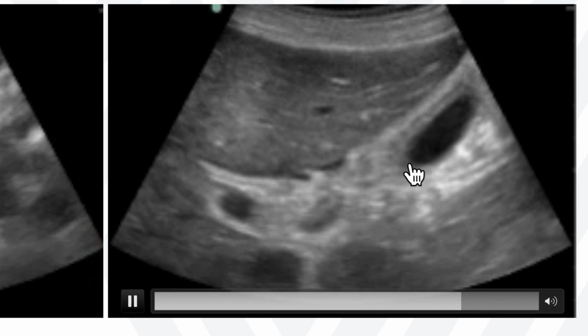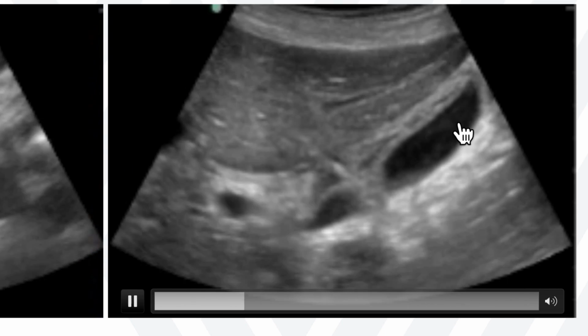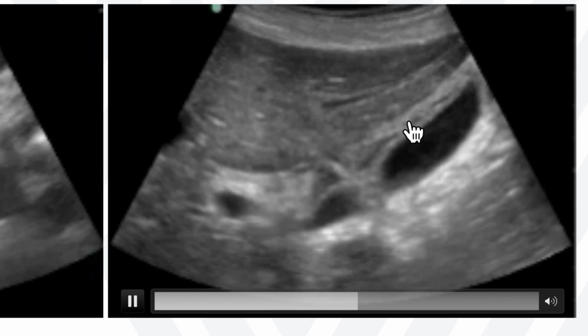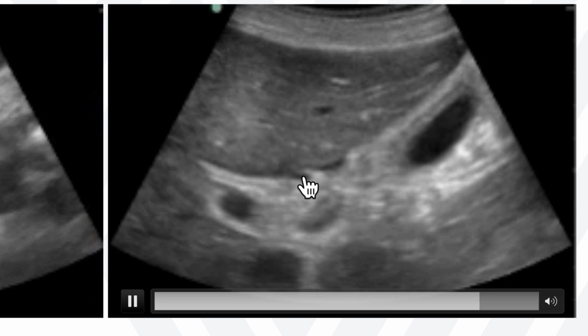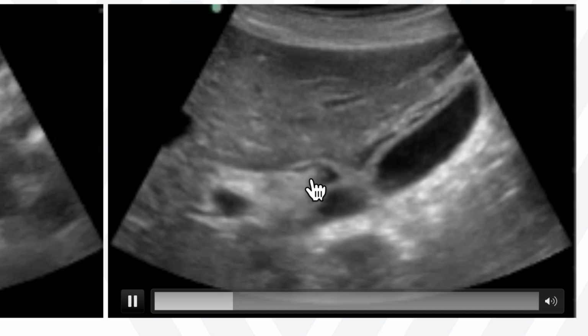In this longitudinal view, just point out liver, portal vein. Here's this gallbladder. I don't see stones or anything in it, but we definitely see a thickened, kind of layered, irregular looking wall. We even see a little bit of pericholecystic fluid here, kind of between the gallbladder and the liver. So this has definitely some inflammatory findings.